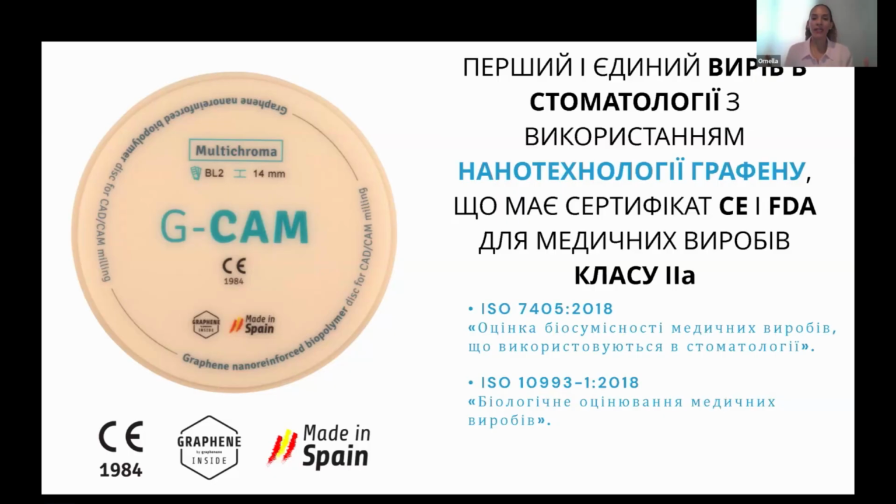So what does this mean? This means that when a medical device is in the range of a class 2A, it is for permanent solution, okay? But in this range, we can find different materials, okay? We can find zirconia, metal ceramic, graphene composite. Different materials. Now here is when we have to decide what we want to provide, or which is going to be the best solution for my patient, okay?